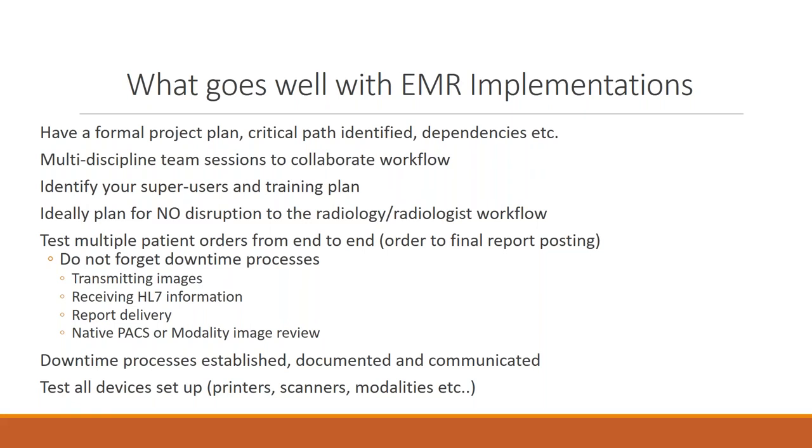Make sure you document downtime processes. You're going to have to break the system to know what it is, or talk about what happens when it breaks, and you're going to have multiple different breakdowns. If it's transmitting of images, that's one thing. Now you have whether you're receiving HL7 information. Is the report not getting back? Is it the native PACS down, or is the modality down? What's happening, and each step should be identified. That downtime probably should be established, documented, communicated, and practiced. And then make sure you test all devices.